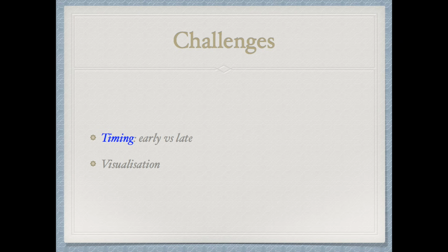Visualization is somewhat difficult if the trauma is involving the cornea. We try to handle the graft to put the eye in a good visualization, or even, if we need to, put a temporary keratoprosthesis. We will keep it until finalizing the vitrectomy surgery and then put a graft.